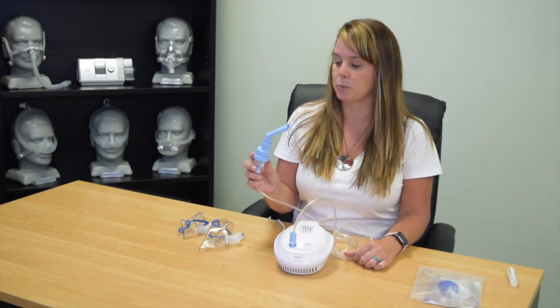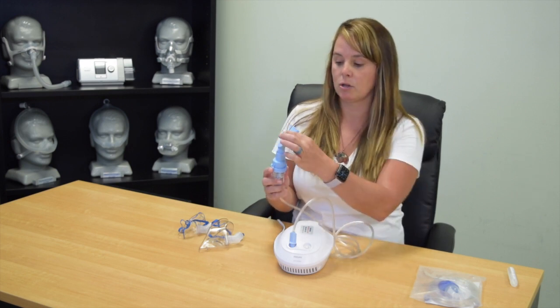So when I am ready to do my treatment, I'm going to breathe naturally with some nice deep breaths in between, maybe a little bit of a breath hold to make sure that the medication is getting deep into my lungs where it's going to help with my breathing issues. So when I use it, I'm going to put this in my mouth behind my teeth and close my lips around here. I'm going to keep the mouthpiece in my mouth when I'm inhaling and I'm exhaling. I'm going to swallow normally when I have this in my mouth.